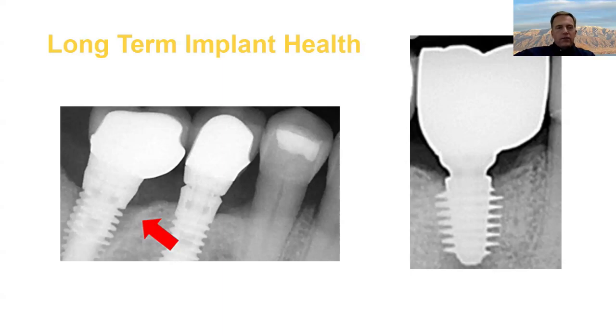And this is an example of no platform shift. See how the abutment is kind of flush with the surface of the implant? And this is a platform shifted implant here. You want this because I think the current studies are leaning towards keeping the bacteria in this micro gap away from the bone leads to better bone retention.